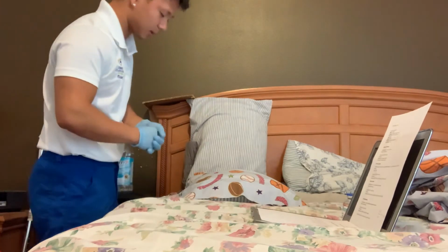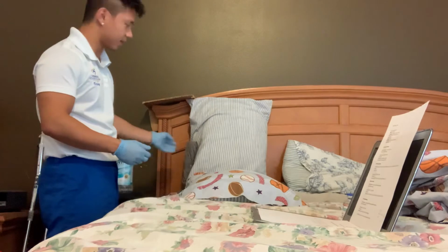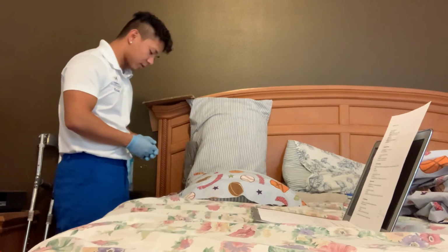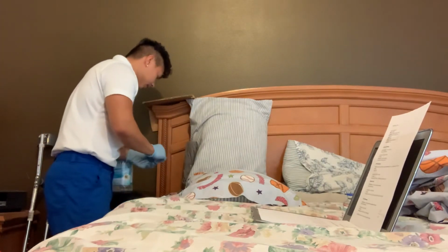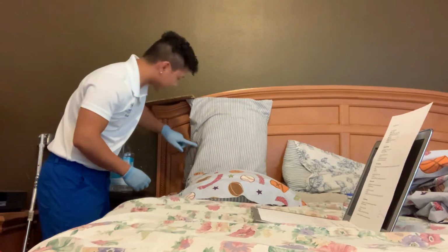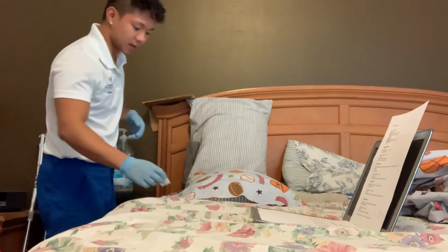Once I've donned the gloves, I'm going to select the correct administration site. So I'm going to use the deltoid. So I'm going to have him relax it and put it on the side of his body. And now I would use a clean new alcohol pad, and I would clean the area in a circular motion. So I'm going to again use the acromion process. Use 2 fingers in that area there. I'm going to allow it to dry.